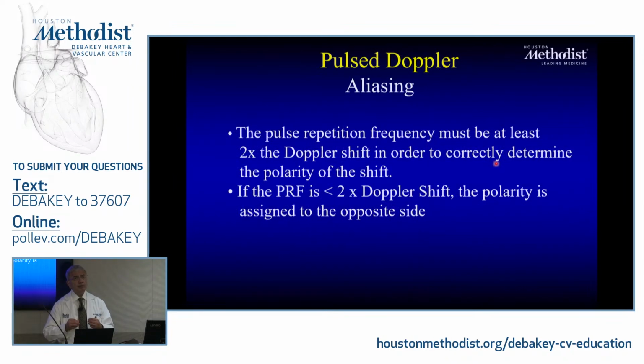So what is aliasing? Remember, for me to get this Doppler signal, I have to send a burst. And how fast do I repeat it? I have to wait for it deep enough to come back to me for me to send the next burst. And the third one, and I may do 3 or so to get a better idea than from a single one.